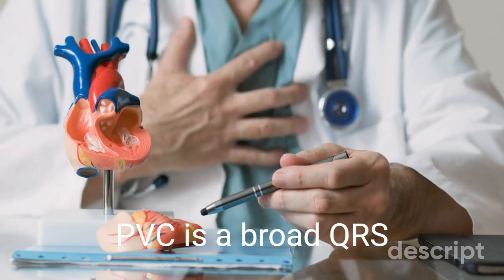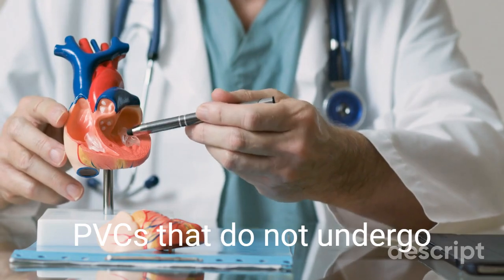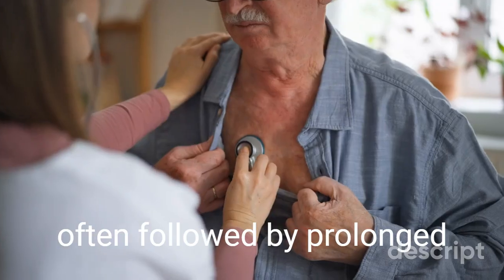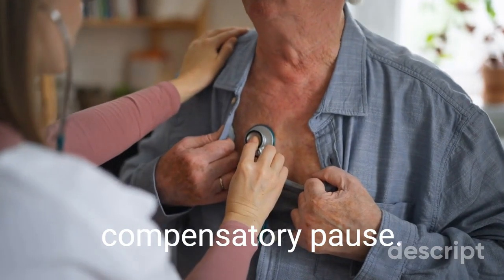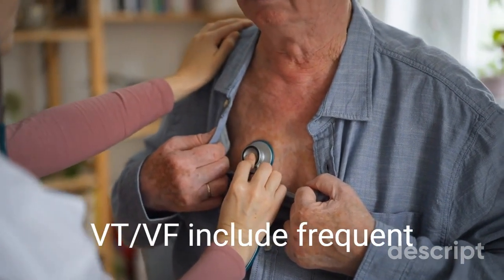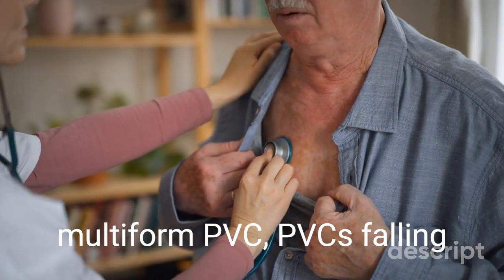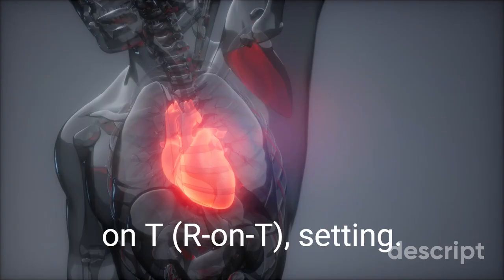PVC is a broad QRS complex, oddly shaped due to abnormal ventricular depolarization. PVCs that do not undergo the conduction pathway are often followed by a prolonged compensatory pause. Characteristics of PVCs that are susceptible to VT, VF include frequent PVCs, grouped PVCs greater than 3, multiform PVCs, and PVCs falling on the T wave, R on T.